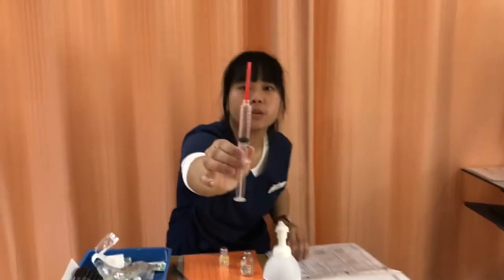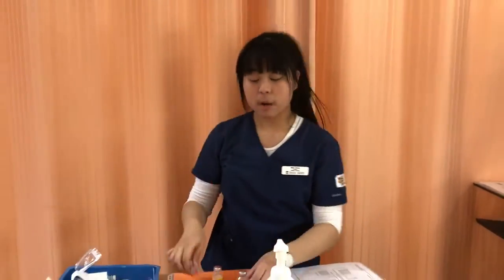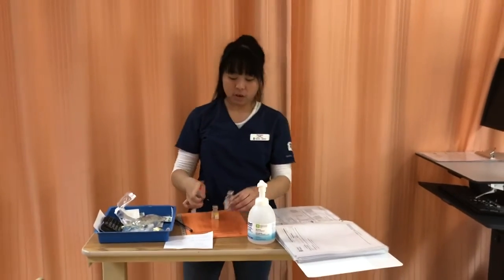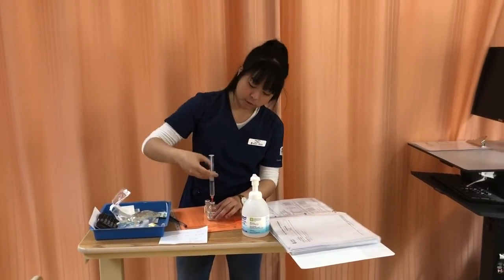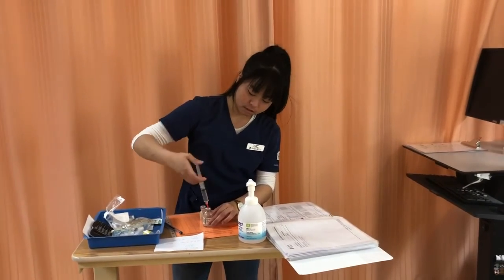Again, so I have my 8.2 normal saline right there. And now I'm ready to do my reconstitution. So I didn't touch the lid of the vial as well, so I can just inject on it. And I will do it slowly to prevent any air bubbles.